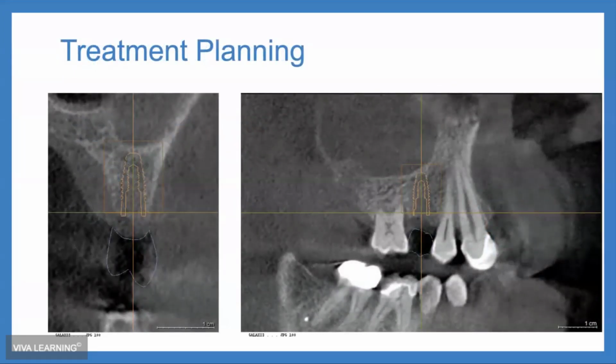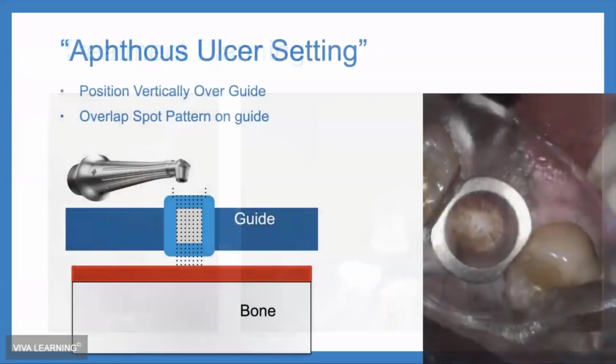So, of course, being digital dentists that we are, we have CEREC technology, we have CT technology, we have a lot of different toys. We always plan everything crown down, of course, and we want to integrate our Sidexis program to do that. And you can see here where the implant has been placed under the crown, which is the best place for it. And then we're going to try to simulate what we're doing here.